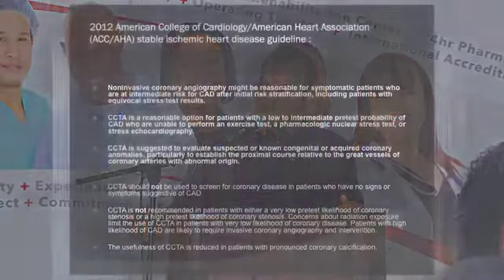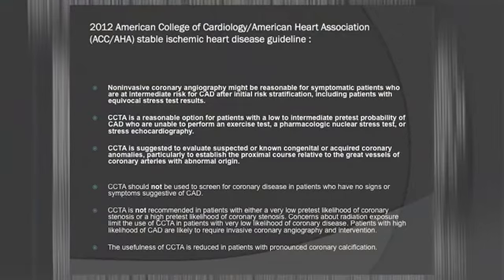This, however, has many things written on it, but this is a recommendation of the American College of Cardiology in 2012, which says that it should not be used to screen patients who have no signs or symptoms of CAD. But it also says that if there are two groups to say no to, those are the extremely low risk and the extremely high risk.